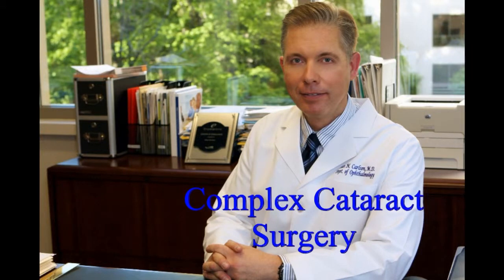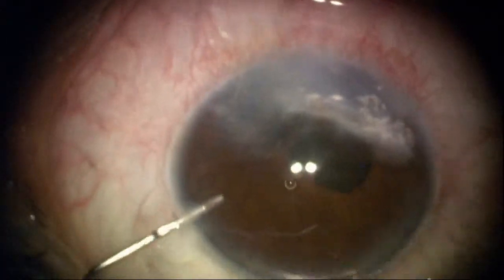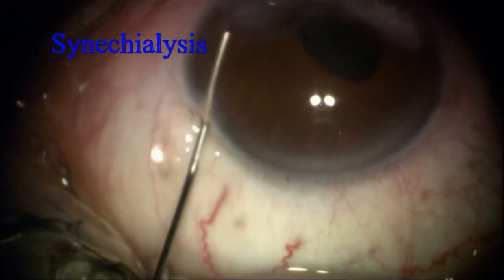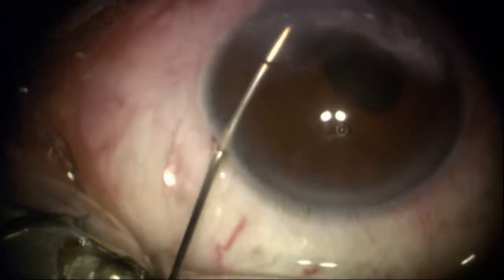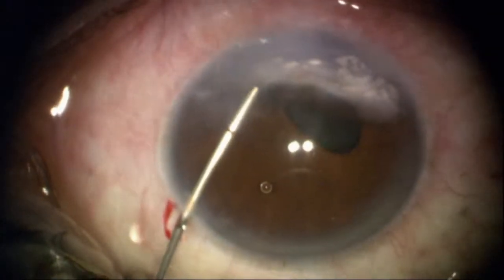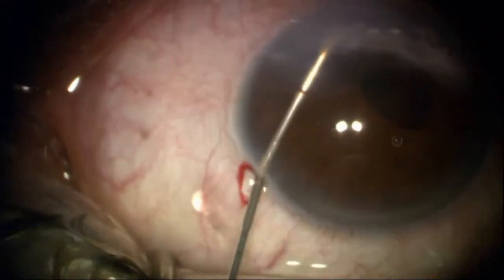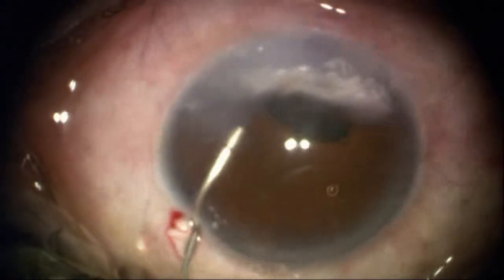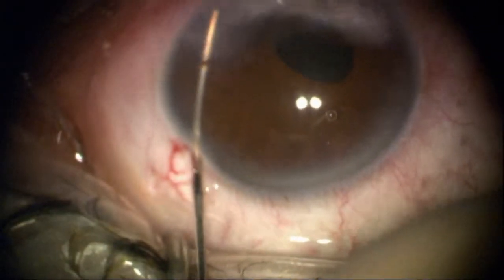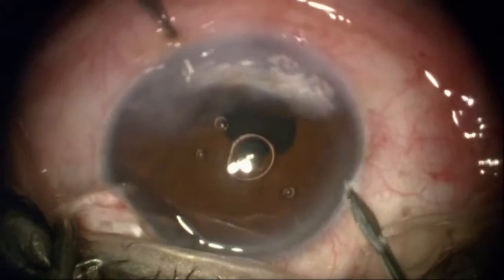This next case is a complex cataract procedure in a patient who sustained severe injury to the eye years ago, now with inferior scarring, band keratopathy with visible calcium deposition, and over four clock hours of dense anterior synechia right up against the back of the cornea.